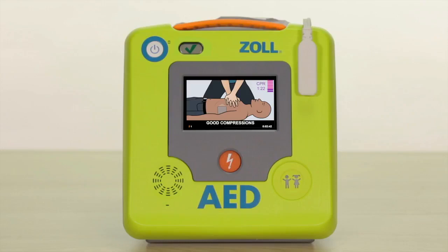Note that the ZOLL AED 3 Wi-Fi connection will not pose any security risks to your Wi-Fi network. It operates on your Wi-Fi network behind your firewall and is only capable of uplink transmission of data from the AED. It is not capable of downlink communications from an outside network through the Wi-Fi connection. It also cannot communicate internally with other devices on your network. Additionally, data that is transmitted from the ZOLL AED 3 to your program management contains no sensitive data, and the data would need to be parsed to read it.